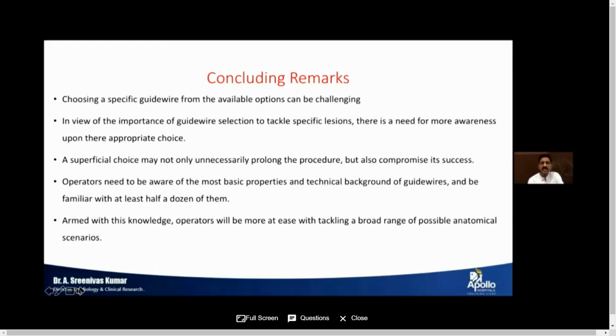Whereas if you're dealing with a situation where there is more angulation, tortuosity, calcification, you need better support strength. You need wires which have a stronger core inside. That is what we use, as Iron Man and Grand Slam type of wires. And for CTO wires, generally most CTOs could be crossed with Fielder XT because of a faint channel, if it is there. Otherwise, when you switch over, probably we use the Gaia series, but if you're comfortable using the Pilot series, whatever you become comfortable with. And when you're switching over, because of stiffness or some other problem you're encountering, switch over to a different make altogether rather than switching within the same type of wires.